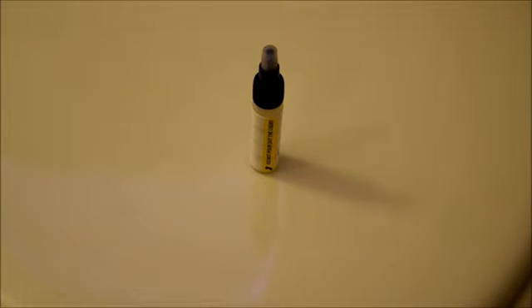Note, it is very important that you do not overfill the collection tube. If you overfill the tube, you will be required to repeat the test, and we want to avoid that. So please do not fill the collection tube with stool sample. Now that you have your collection tube label filled out, you're ready to get your sample ready for collection.